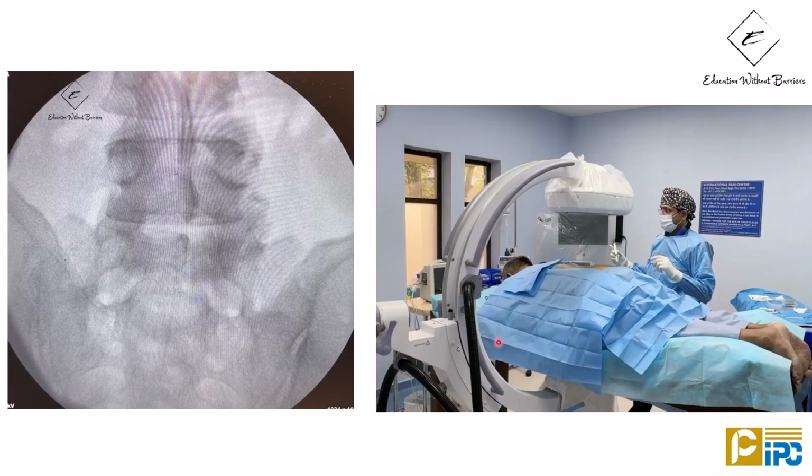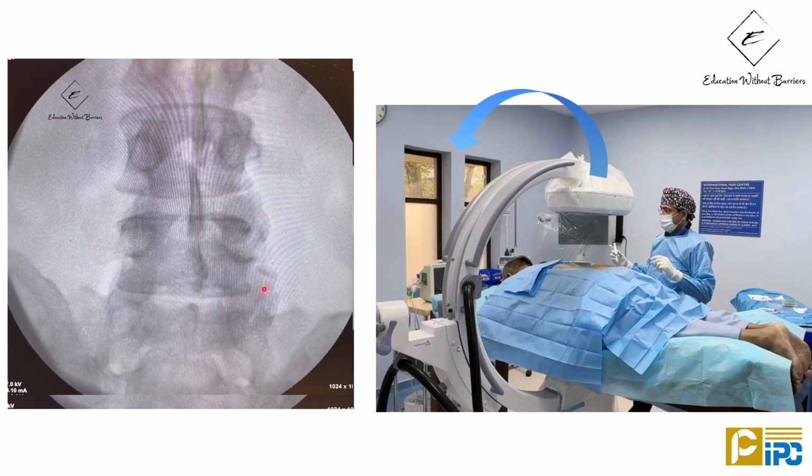So this is a patient who's lying. We're going to do a nerve root block. So we've got the C-arm positioned at the right level. So for the lower levels, I'm going to do a caudad tilt, which is in the direction of this arrow. So we're trying to square this vertebra. Look what happens to the images. It's not squared. I can still see two lines over here.